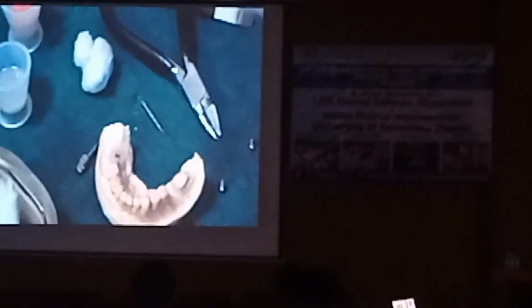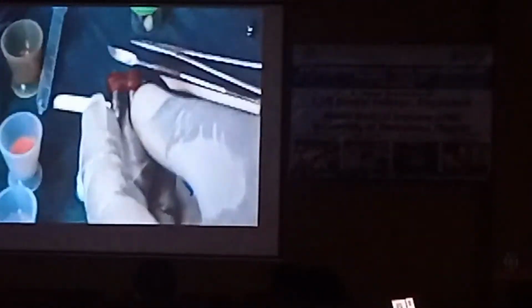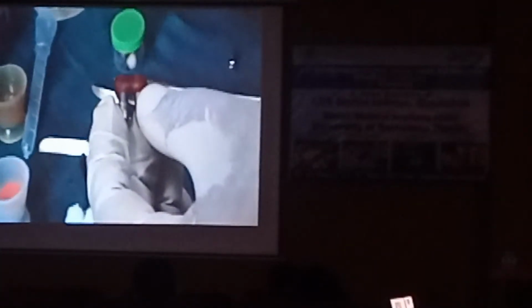They are more easier to manage. This is a close one, but we manage it. So we make this work a bit. Okay, now the step that we are going to do is we are going to section it. So how will you section it? With a disc. Do we have a disc? Where is the disc? In the lab. So they will go to the lab and they will cut it from the center. Bring it.